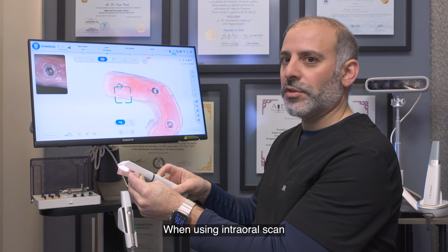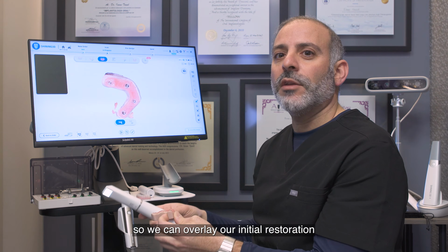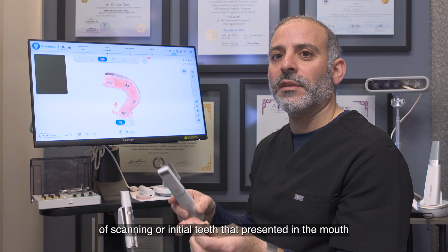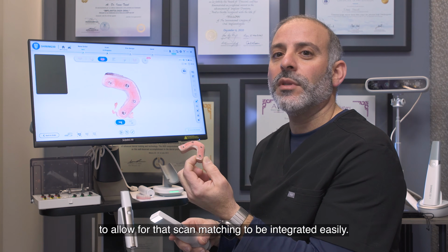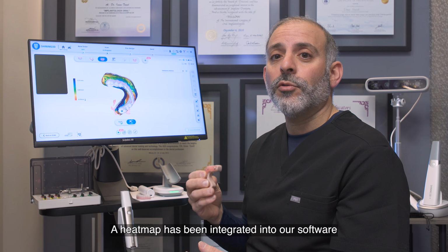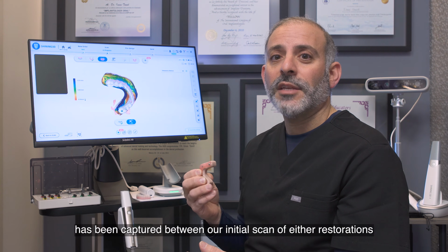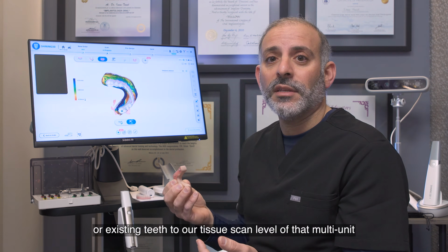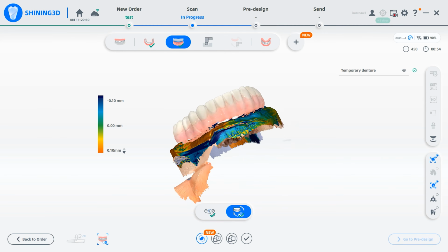When using intraoral scan matching, it is imperative to capture as much data as possible so we can overlay our initial restoration scan, or the initial teeth that presented in the mouth, to the multi-unit tissue scan level to allow for that scan matching to be integrated easily. A heat map has been integrated into our software, showing how much of the accuracy has been captured between our initial scan of either restorations or existing teeth and our tissue scan level of the multi-unit surfaces.